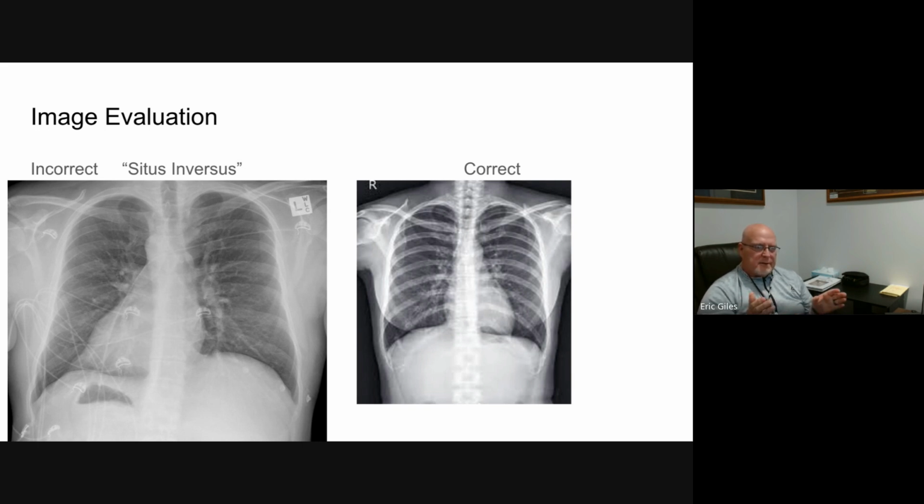Now let's talk about the correct chest x-ray, how it should look at you. Skeleton dude is staring at you. So the picture's staring at me. Is his heart on the left side? Yes, it is. Is it marked on the right side? Yes, it is. So that's correct. Okay. Anyway, good deal. Use your markers so we can prevent something from happening and get you out of a bind.